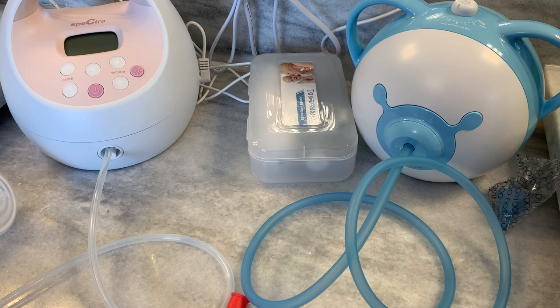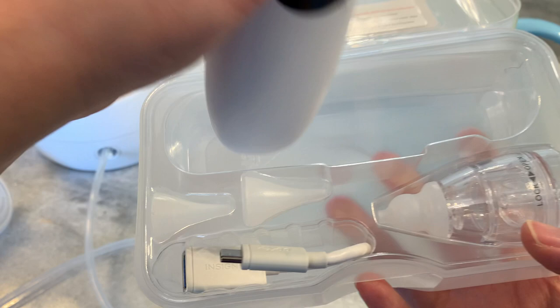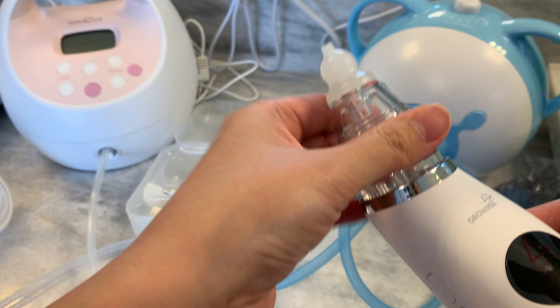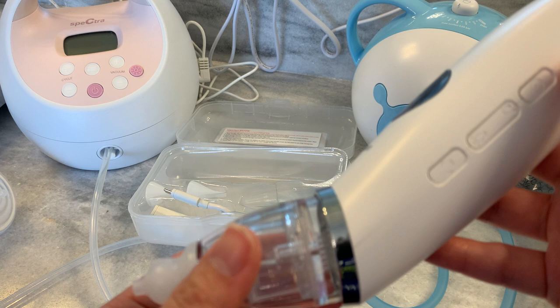Next, we're going to move on to the small electric nasal aspirator. I don't know what brand this is, but most of these retail for about $40 on Amazon. The manufacturer says it has a suctioning pressure up to 65 kilopascals. For comparison, the Spectra S2 has suction up to 250 millimeters of mercury. When you do the conversion from kilopascals to millimeters of mercury, the manufacturer is essentially claiming this will have almost double the suction of the S2.